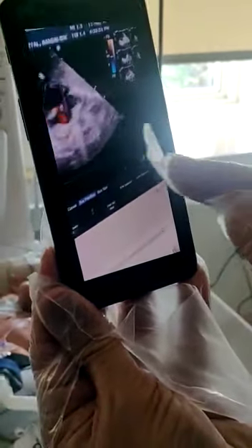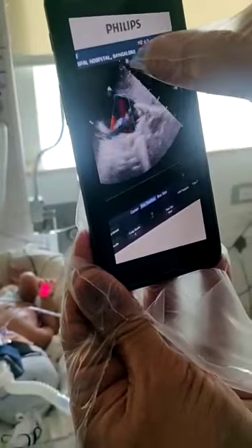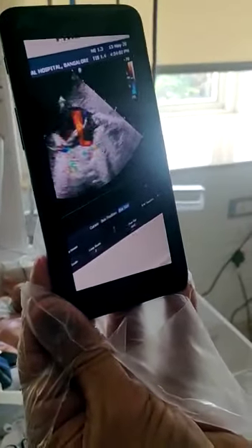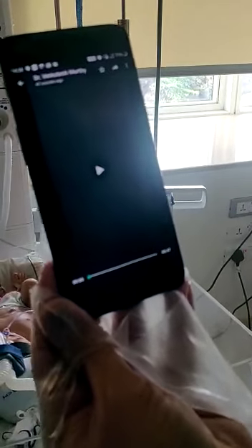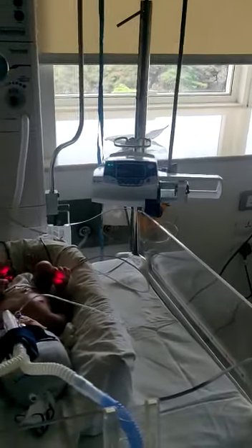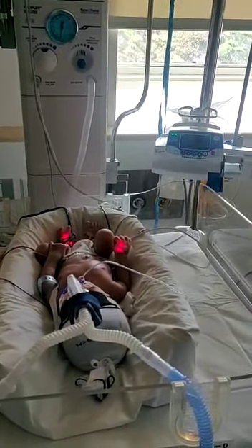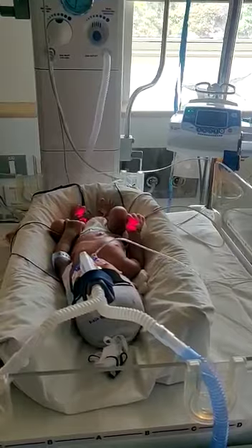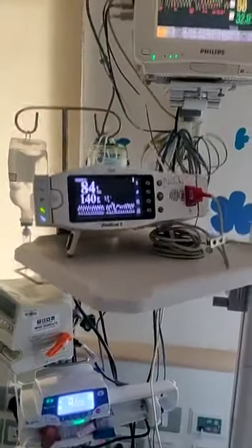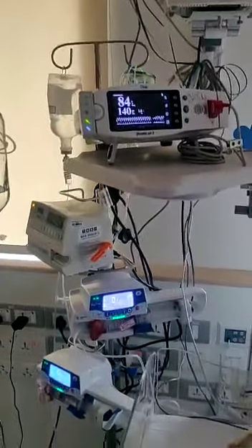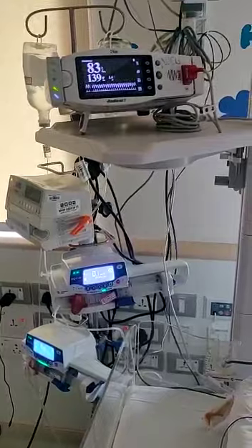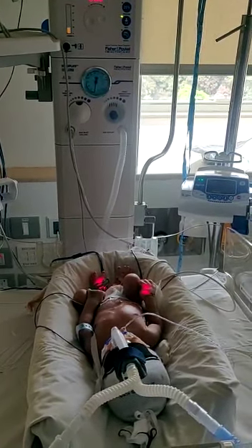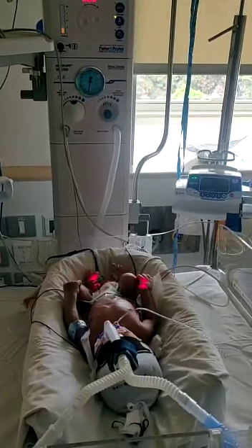You can see beautifully that the flow started as a left-to-right shunt between the left atrium and right atrium. This is very important because in ventricular-arterial discordance, as seen in transposition of great vessels, the sustenance of life mainly depends upon the mixing of pure and impure blood. The moment this shunting was created between the left and right atrium, the saturation started to improve — from 40s before the procedure up to 84%, which is very good for this baby. The parents were counseled, and now the arterial switch procedure is planned in a couple of days. Thank you very much.